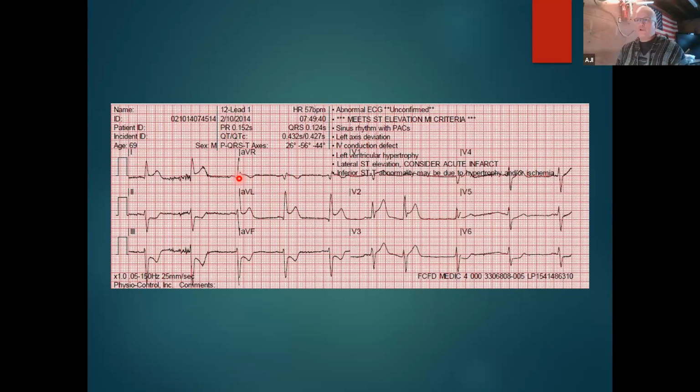So, a note for transmission: HIPAA is a huge thing. However, when we're transmitting EKGs, we're doing it for a reason. Whatever monitor you're using, you have the ability to enter patient information in there. So put in a name, an ID, and their birthday.